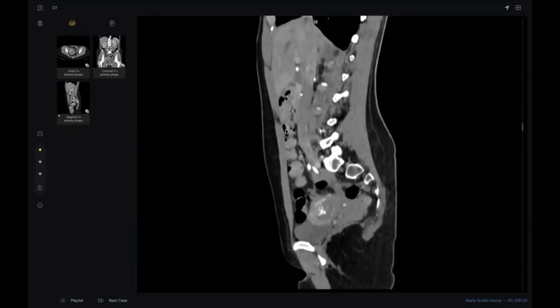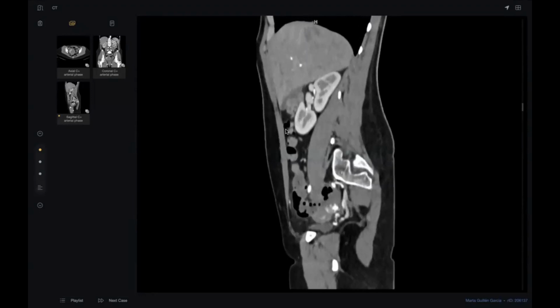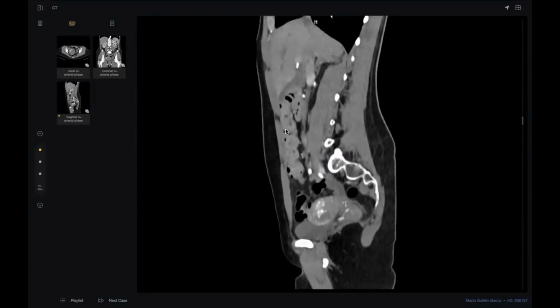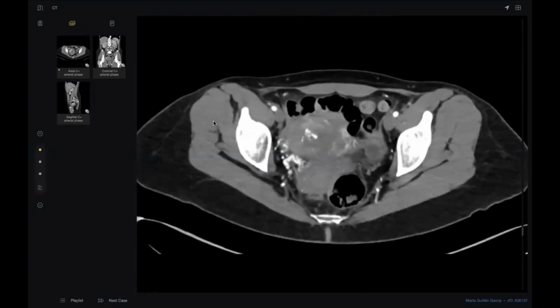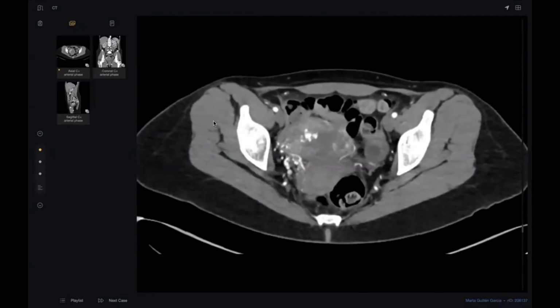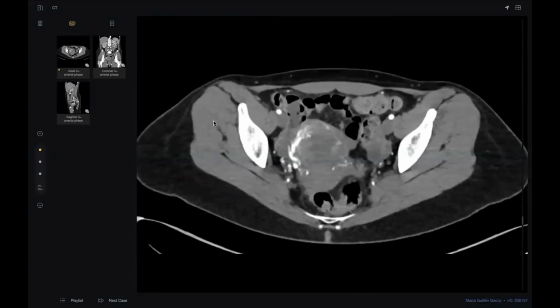Okay, excellent. But what is this? Look again, no signs of hemoperitoneum. Look again here. What is this? Uterine artery dilated and tortuous, intramyometrial. I have suspicion of AVM. There is a nidus. Excellent. Tortuous vessels with serpentine vascular structures ending into a nidus within the myometrium, and also the uterine cavity is distended, fluid filled. There is no free hemoperitoneum or free fluid.